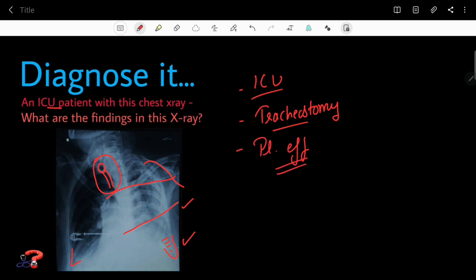On the right side, you can clearly see there is opacity in the center part, and in the periphery there is a hyperlucent, more black-colored area. This black-colored area in the X-ray is showing the presence of air, and this excessive air shows that this is pneumothorax.